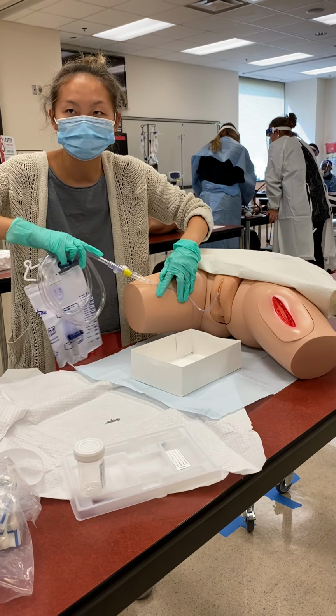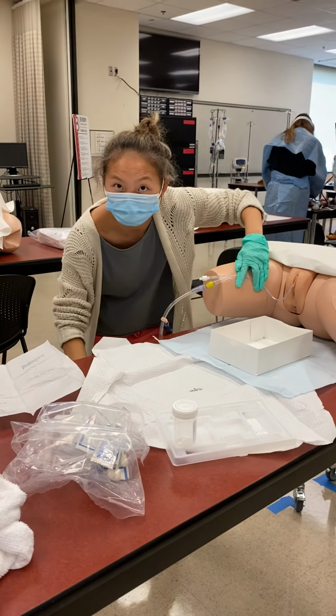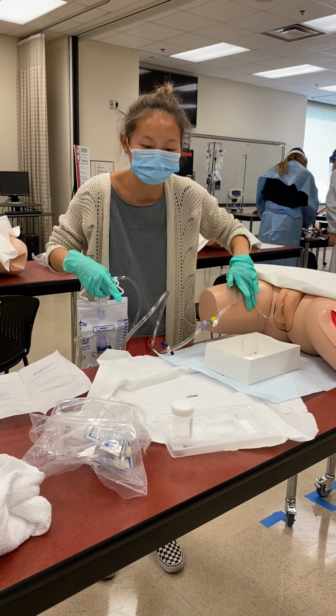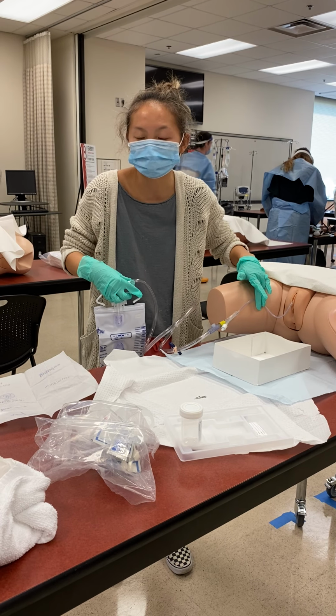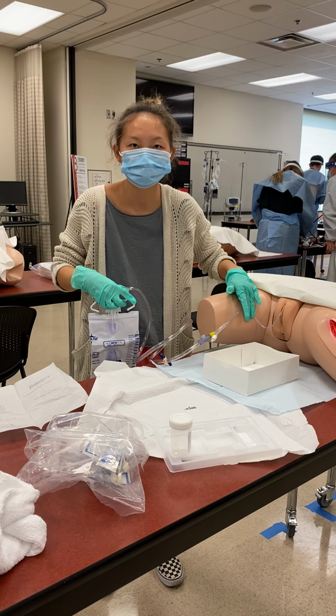And we would want to hang this below their bladder onto a non-movable part of their bed. And once we had that all situated, we would make sure we help clean up the rest of our supplies and provide patient privacy and put the linens back over and lower their bed and put their call light next to them.